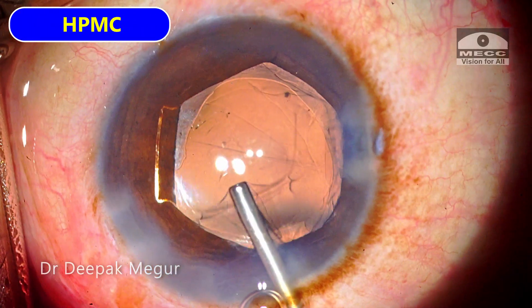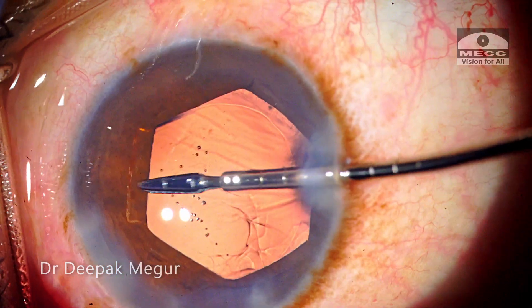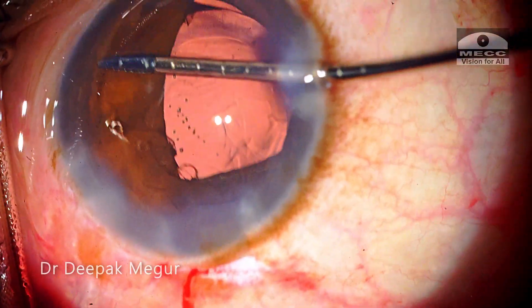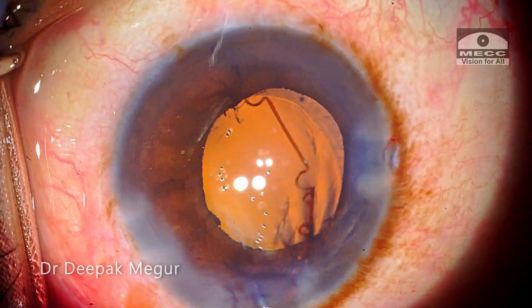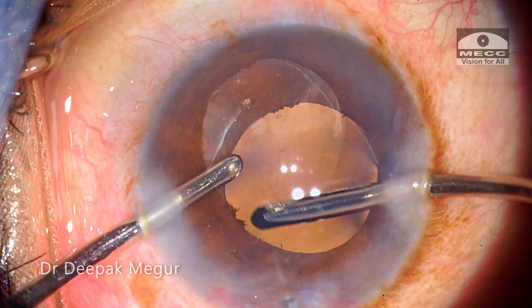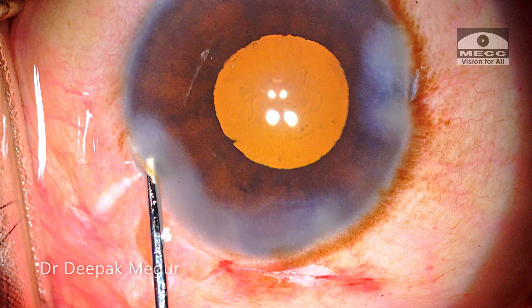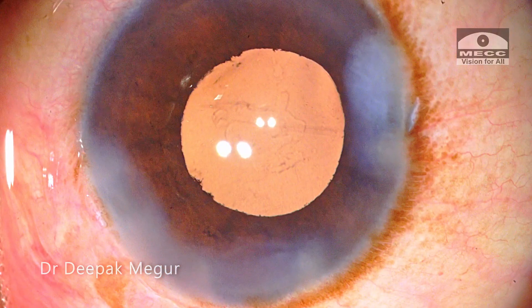This is critical to confirm, as we don't want the thick haptic of the single-piece hydrophobic lens to migrate into the sulcus, which could induce chronic inflammation by irritating the uveal tissue. I am injecting HPMC into the anterior chamber and then the BX device is being removed. Since I had noted the existing endothelial damage, I didn't want to take any more chances. The viscoelastic is then removed and the incisions are hydrated.